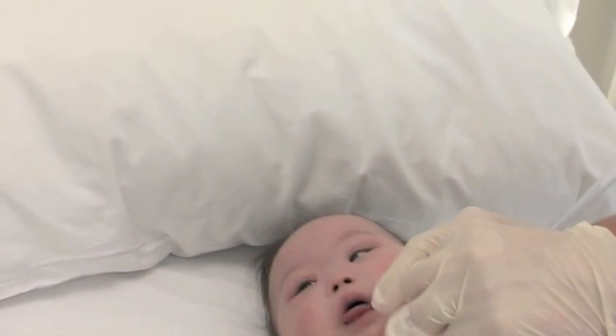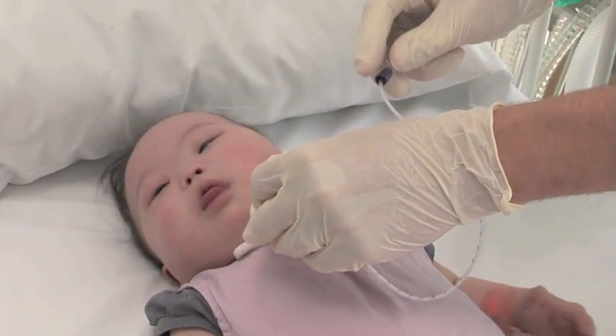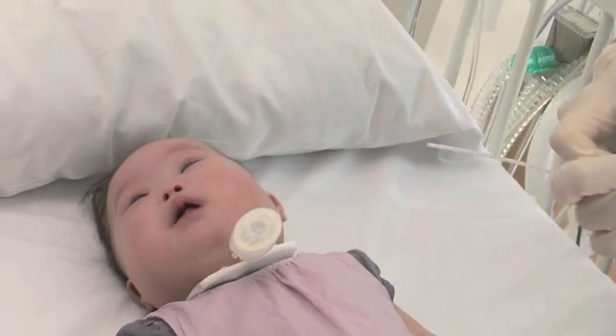Check you are using the correct size catheter. Check the suction pressure — your hospital will advise the correct suction pressure to use for your child. Insert the suction catheter to the correct length without applying suction.